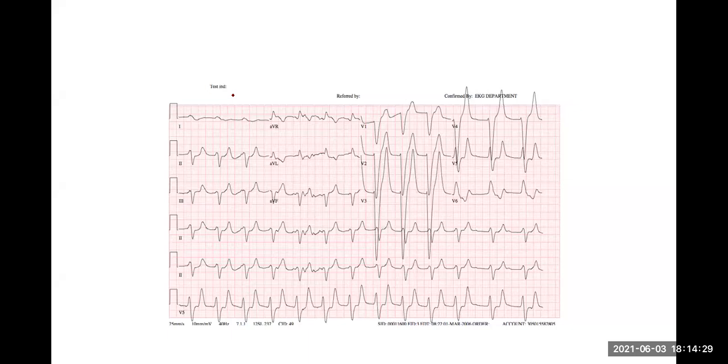Okay, so there's a good thought. Some people thought it was VT. I think the reason is they thought that I told you yesterday that the QRS is broad. It is a ventricular rhythm. So could be ventricular. Neither.